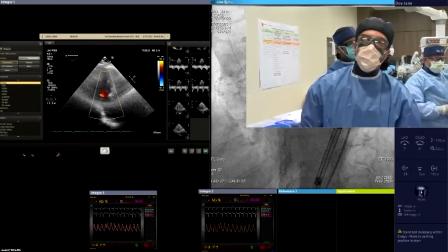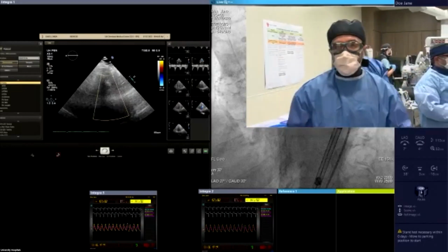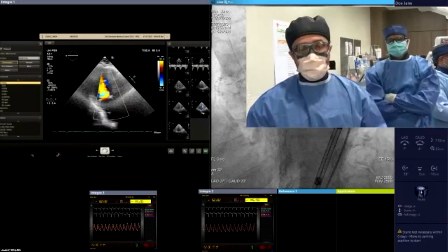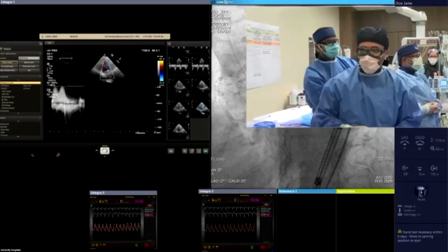We just did it offline. Yeah, but of course we do it all the time. We did it obviously prior to the pre-dilatation, but we did it. And we just didn't show you guys because we didn't have enough time to do so. Thank you. Yeah, of course, absolutely.